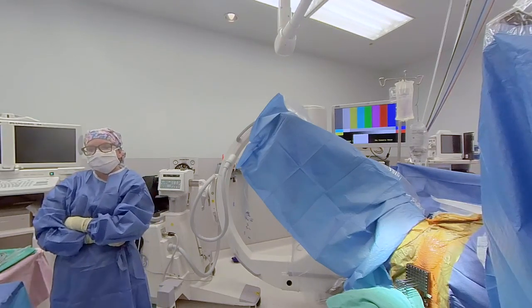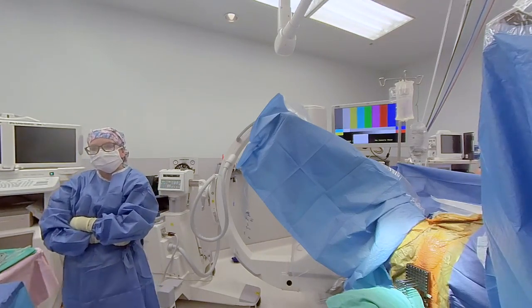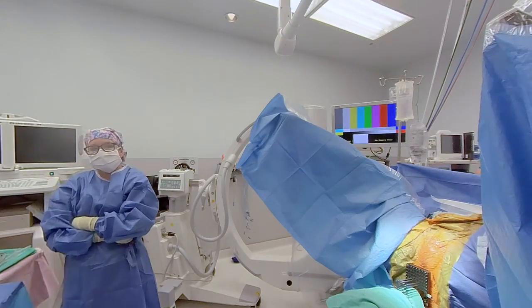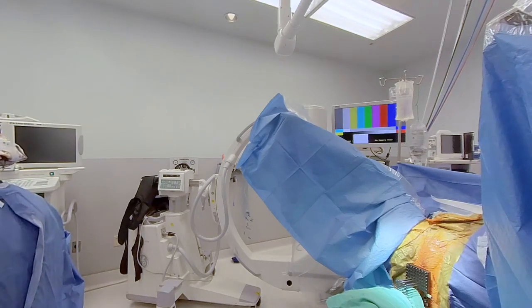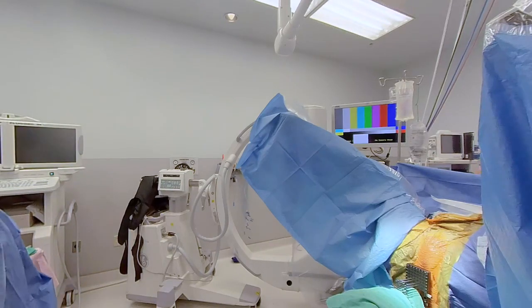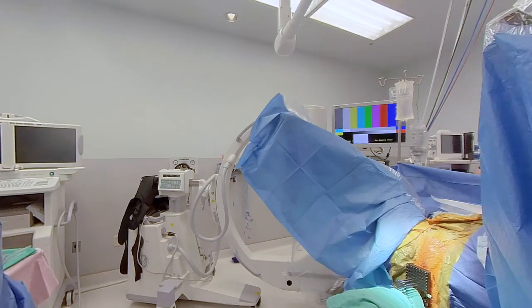Look at our dose rules, which we've reviewed, and it weights the dose rules from 0 to 10. It tells the computer that my main objective is to have a certain dose of the prostate receiving a certain percentage of the prescribed dose. Great. And we'll start the plan. The first iteration is completed in 1.2 seconds. So we look to see if the objectives are met, and they are, but we will make some adjustments to bring it within the dose constraints that we like. The only objective that is high is the V150 prostate, which is above 60. We'll try to cool that down, and the V100 rectum is at 0.62, which is within our constraint, but we try to get it below 0.5.